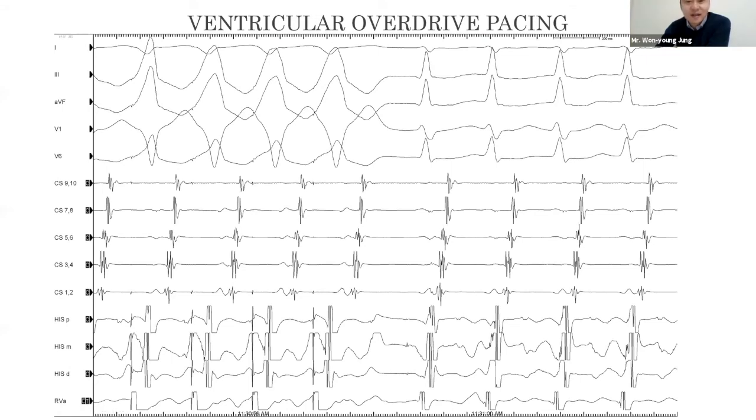I also really love the entrainment ventricular overdrive pacing, like you, Chopin. Yes, thank you. At this point, we need to correct the PPI minus tachycardia cycle length measure, right? Yep. I like that the atrial activation is the same. So it does tell us something. And I'm sorry I didn't measure this for you, but I think PPI is short.